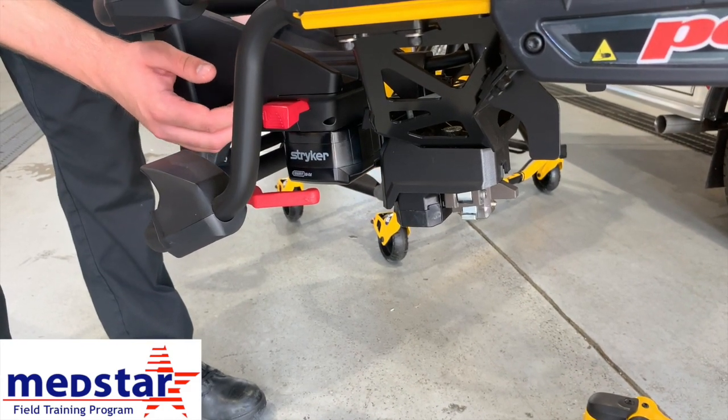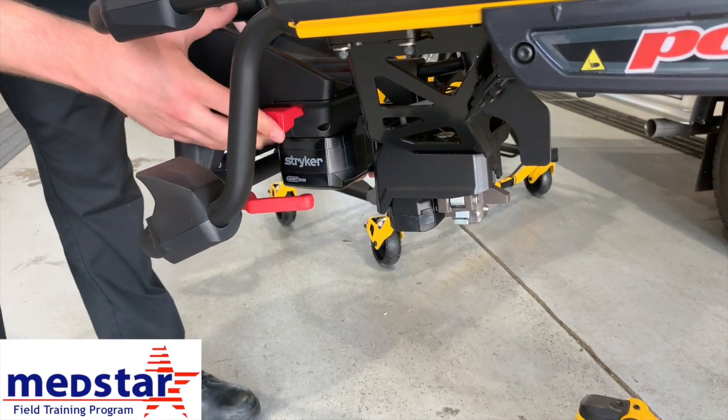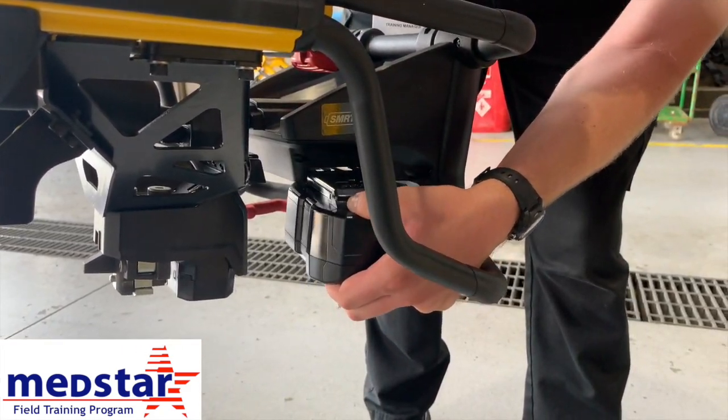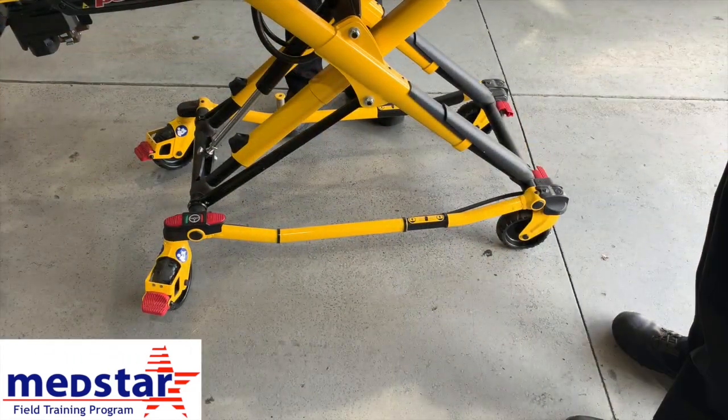We're going to show you how to change the battery on the power stretcher. Push the battery release button — push the red button in — and the battery will slide out on the other side. To put the battery back in the stretcher, line it up and slide it right in. You'll see the indicator light on the front of the stretcher turn on.